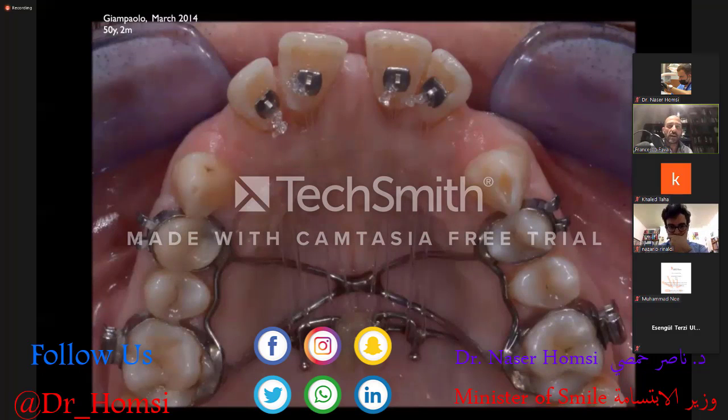Here we have an anchorage device in the upper arch. We have stiffly connected together the upper first molars, on the left and on the right side, and the first premolars on the left and on the right side. The connection of the teeth is very stiff because we have 3 transpalatal bars, one connecting the molars and a cross-welded bar connecting the premolars with the molars, in the shape of a cross. All the bars are soldered together in order to obtain a very high rigidity.